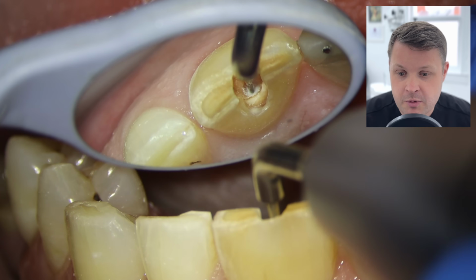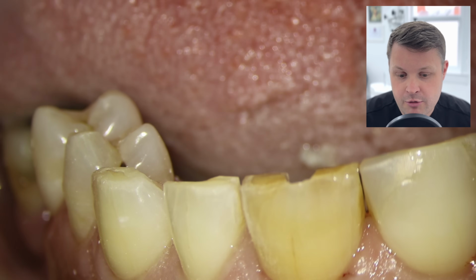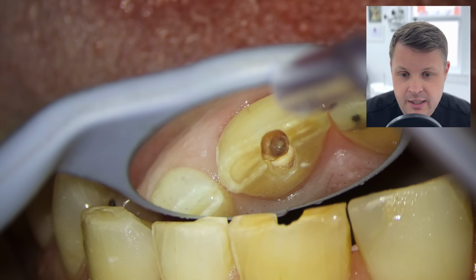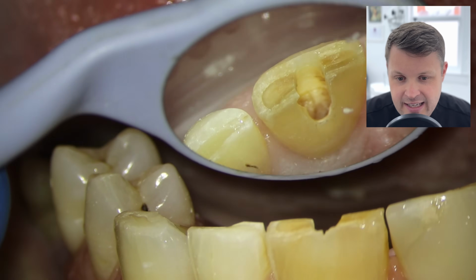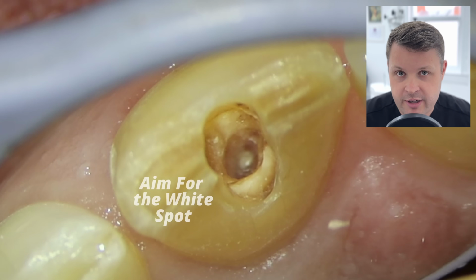So I'm going to move over to these needle-tipped ultrasonics here. These are great for not removing too much tooth tissue, but you can create false orifices. So you've got to be really, really careful in this case. Again, I'm using a high energy ultrasonic just to clean everything out, and I'm just having a little dig around. And again, I'm slightly concerned that I'm not in the right orientation. Maybe I'm a little bit too mesial.